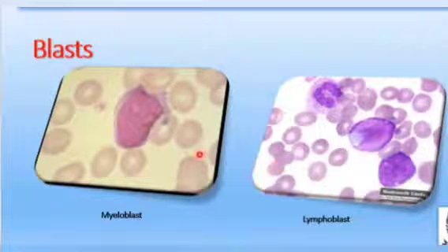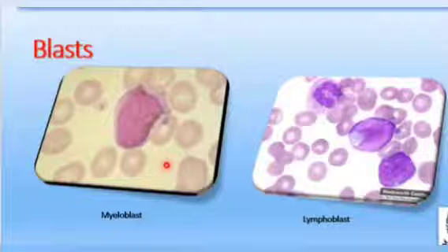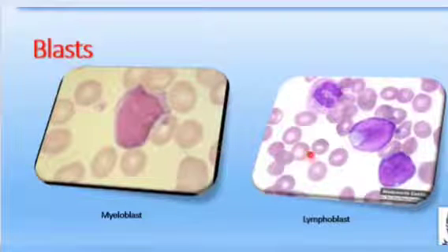If you are dealing with lymphoblastic leukemia or acute myeloid leukemia, then blasts are very important, and the threshold changes: beyond 5%, you look for more than 20% or more than 30%. In the WHO classification, we need more than 20% blasts in the bone marrow or peripheral blood, and in the FAB classification we need more than 30% blasts. So at that time the blast count has very much importance in bone marrow examination.